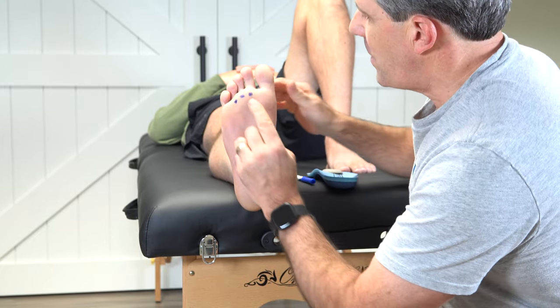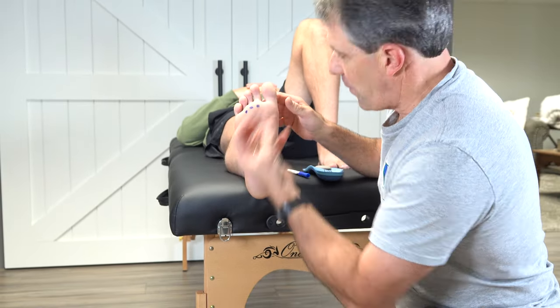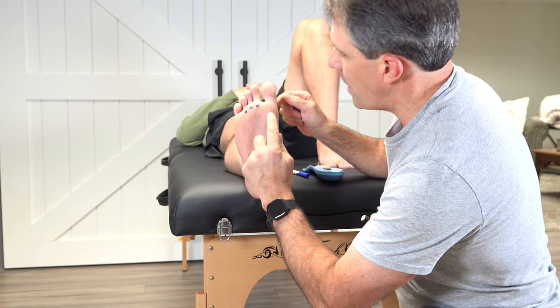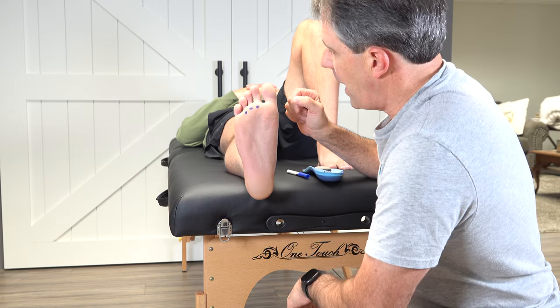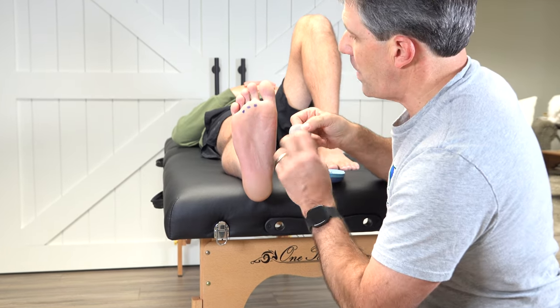What happens is these joints strike the floor too hard, and when they do, they just get inflamed, irritated, and thickened. People will say it feels like they have a sock that's bunched up in here, or maybe there's a stick, or it's like walking on a marble or a rock in this part of the foot. What we want to do is try to take some pressure off of that area by using the metatarsal pad.